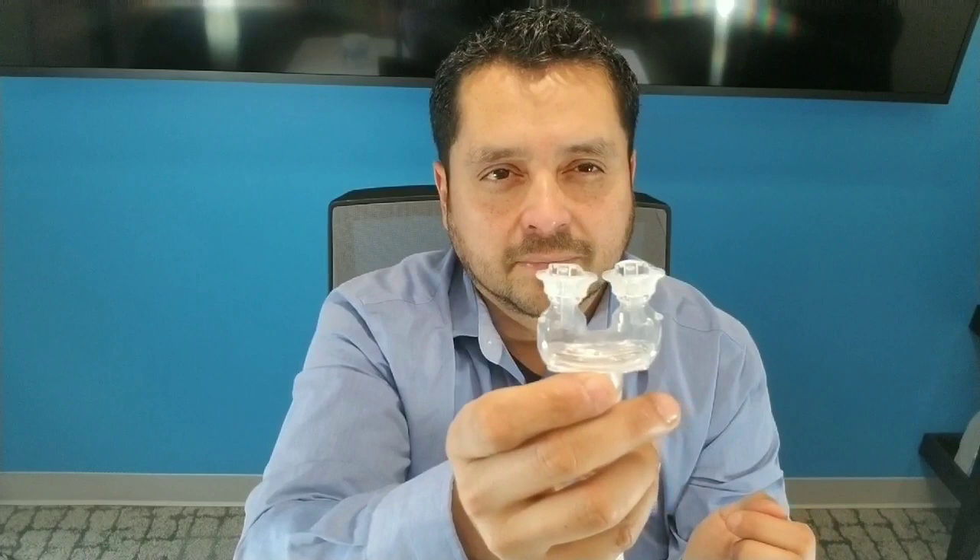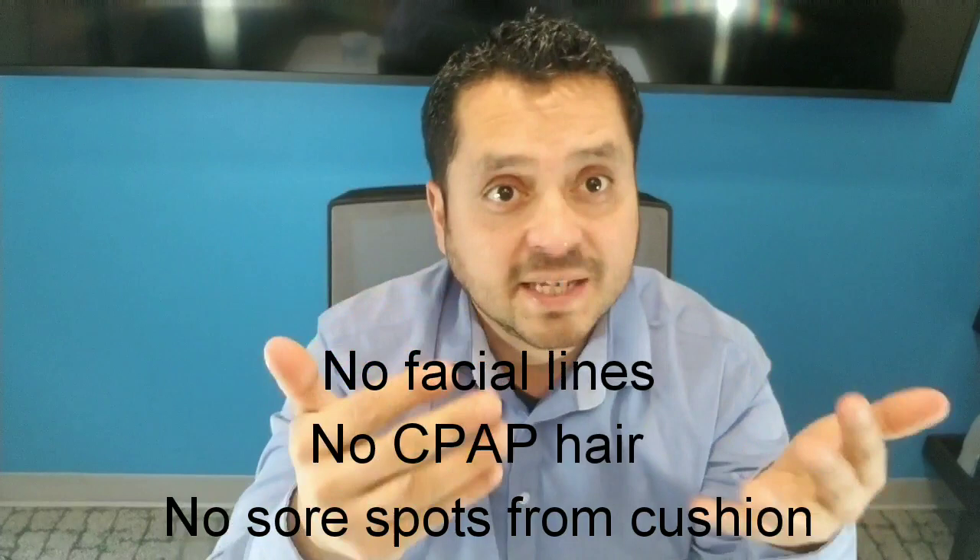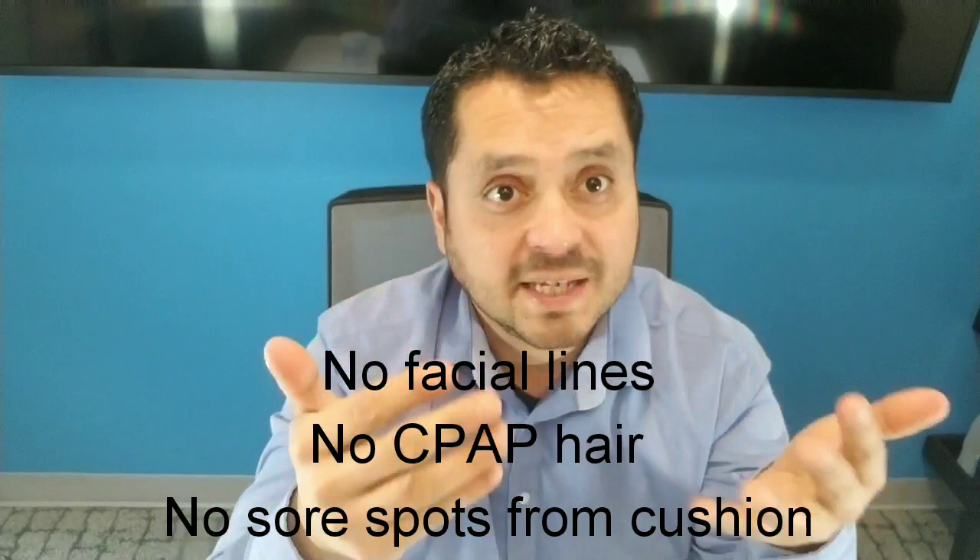Notice something — no lines on my face. There's no headgear. No headgear means no CPAP hair. A lot of ladies have been coming in and complaining that it just ruins their hair, people with long hair. No more lines lingering around all day long, people asking you what's going on. So all of those issues have been removed because there's absolutely no headgear to deal with. And there's no headgear to replace, so you're saving money on that part.